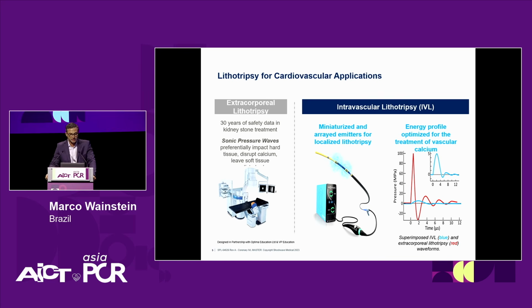So basically, lithotripsy for cardiovascular applications is relatively new, but in terms of other uses, it's been quite old. It's been used for over 30 years, for example, for treating kidney stones, as you all know.